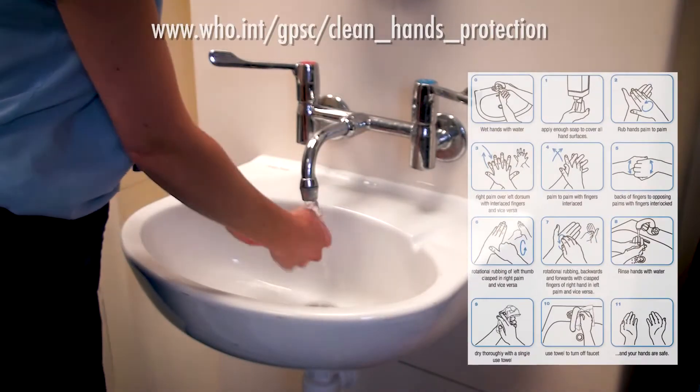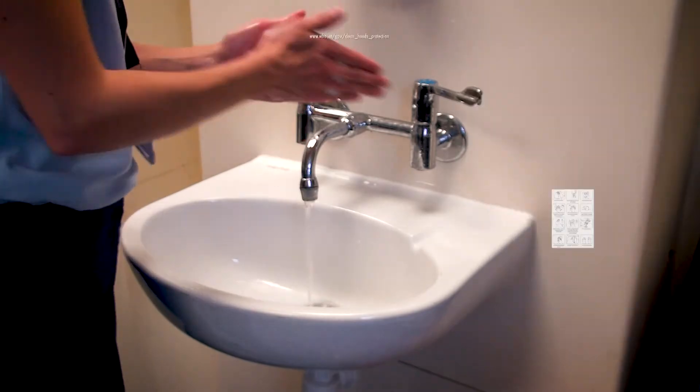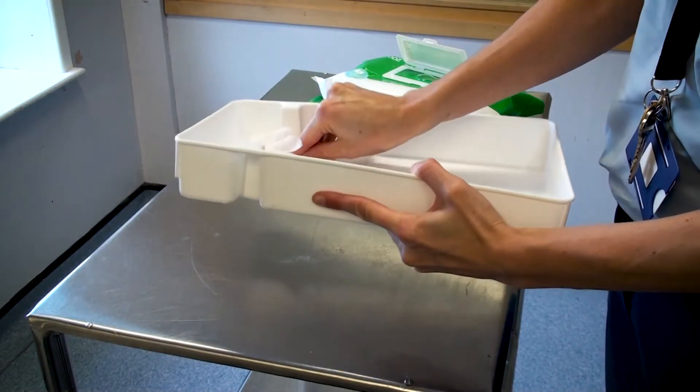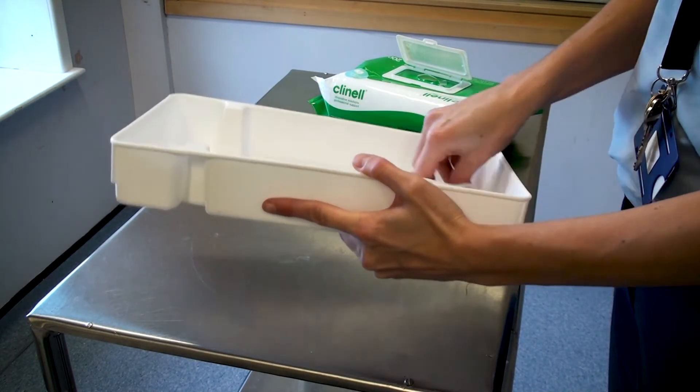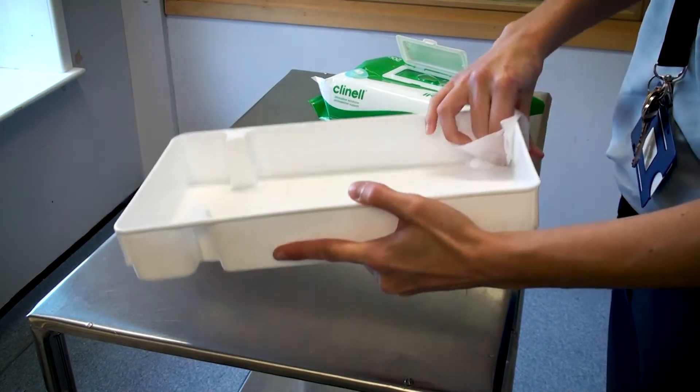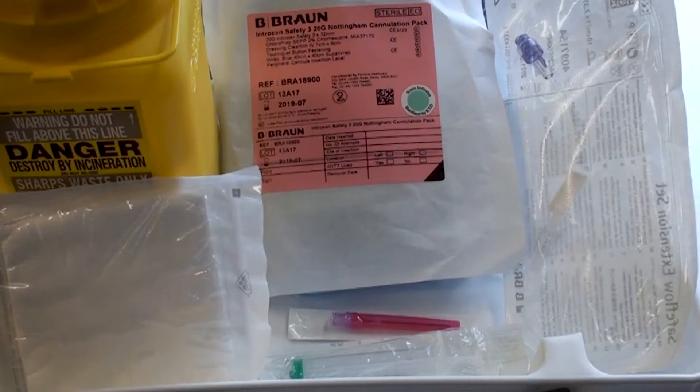You must ensure that you then wash your hands thoroughly using the 11-stage approach. You must now assemble your equipment. Prior to opening the packs and assembling your equipment, you must clean the procedure tray with the appropriate wipe and allow it to dry thoroughly.